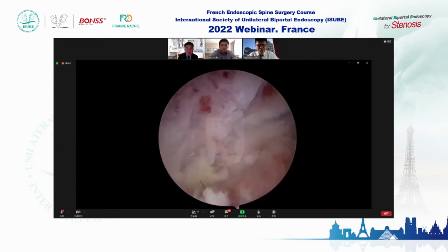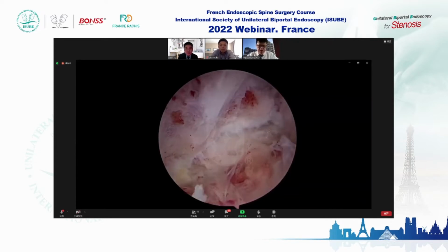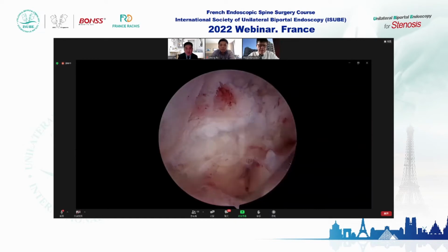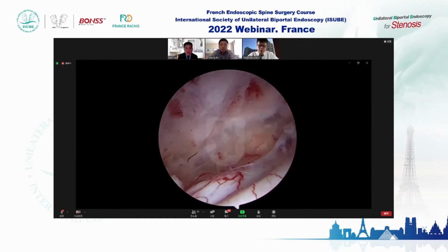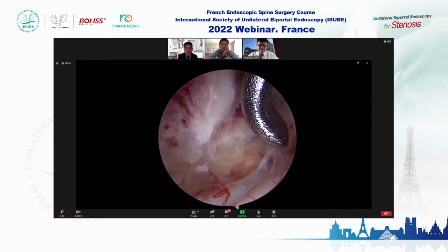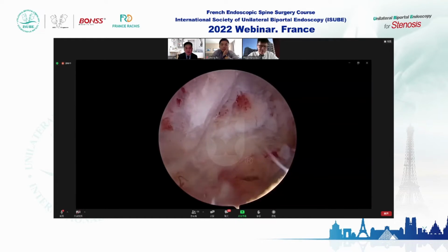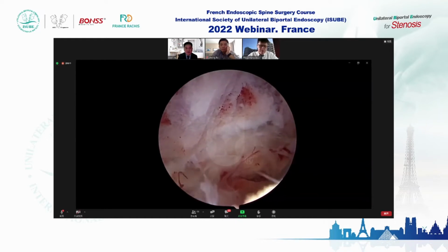So far, I haven't used the third incision in my practice. I do contralateral approach, and I agree it's very difficult to get a central disc from a contralateral approach, from biportal or uniportal. So in this case, I probably do transforaminal because I do both types of scopes. But I think it's a very nice and beautiful surgery done by Professor Zhang Wei. Very nice to watch. Okay, thank you.